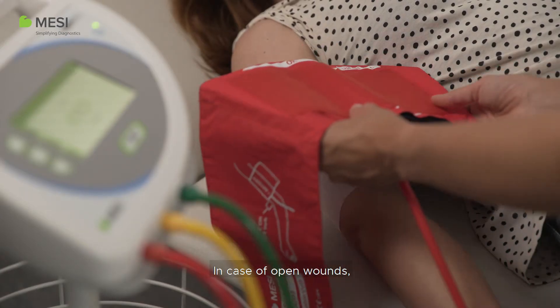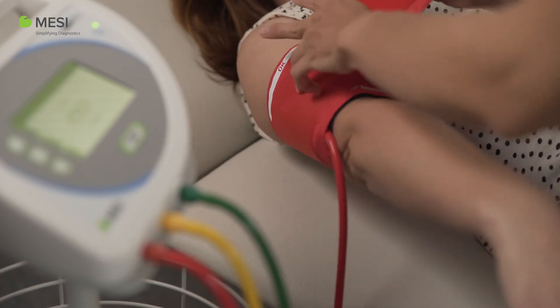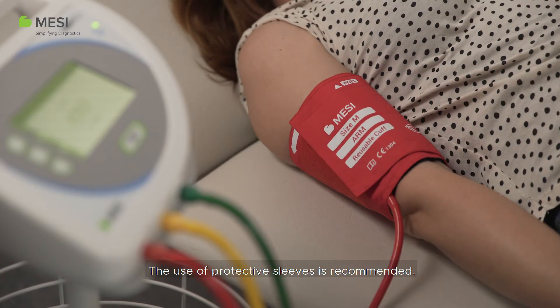In case of open wounds, protect the wounds with adequate impermeable dressing prior to applying the cuffs. The use of protective sleeves is recommended.